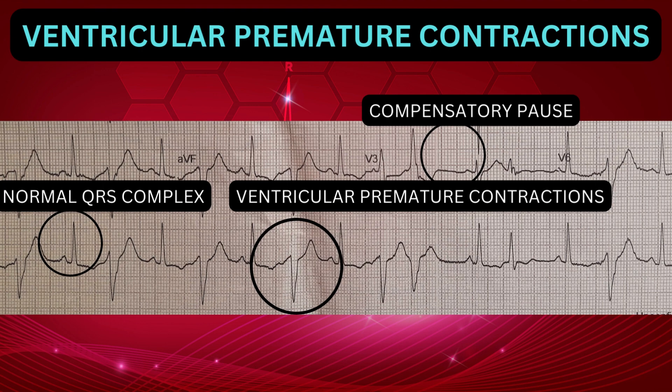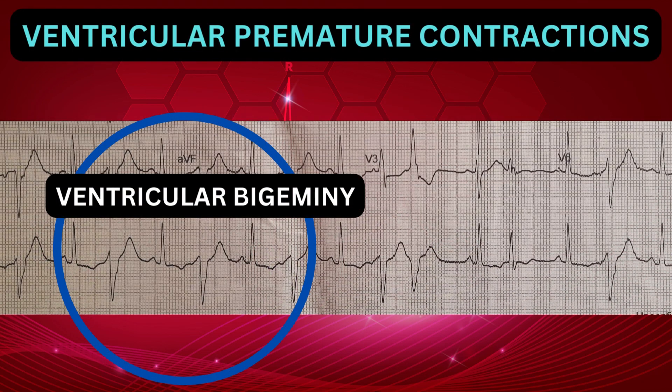In ventricular premature contraction, the heartbeat is initiated by the Purkinje fibers rather than the sinoatrial node. They can occur in isolation or in repeated patterns, with three or more consecutive PVCs being classified as ventricular tachycardia. In ventricular bigeminy, as seen in this ECG challenge, each normal QRS complex is followed by a premature ventricular contraction.